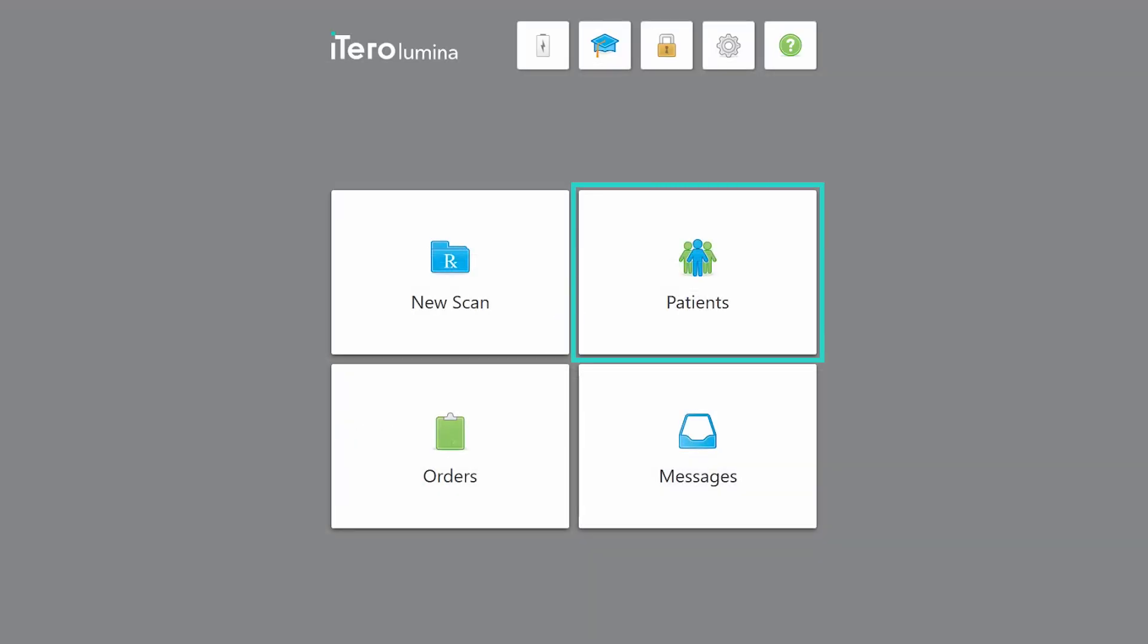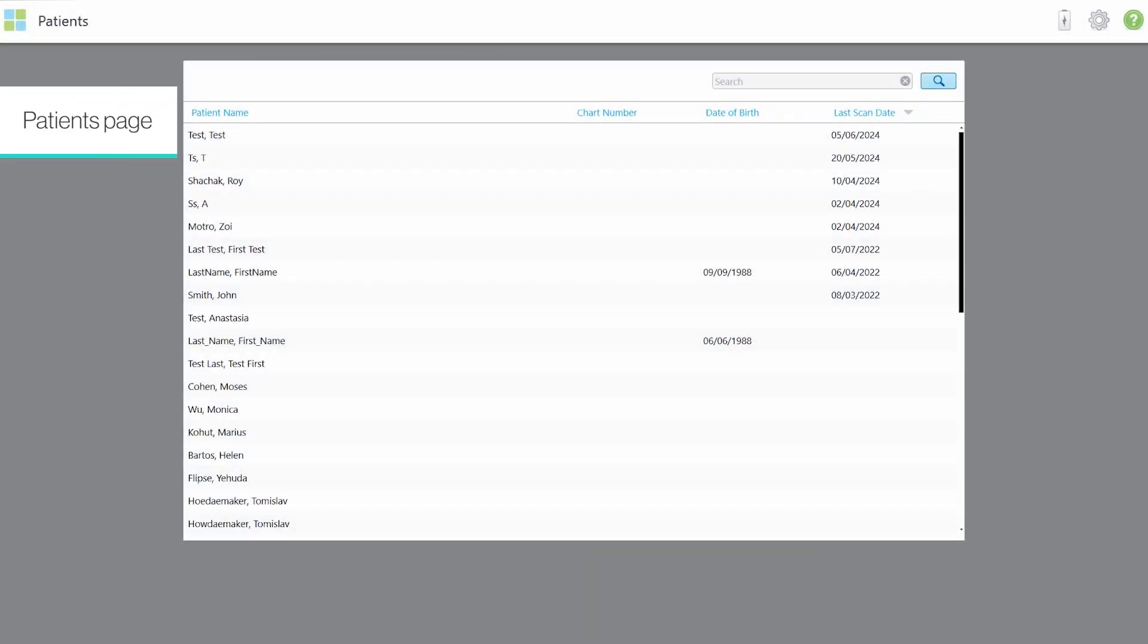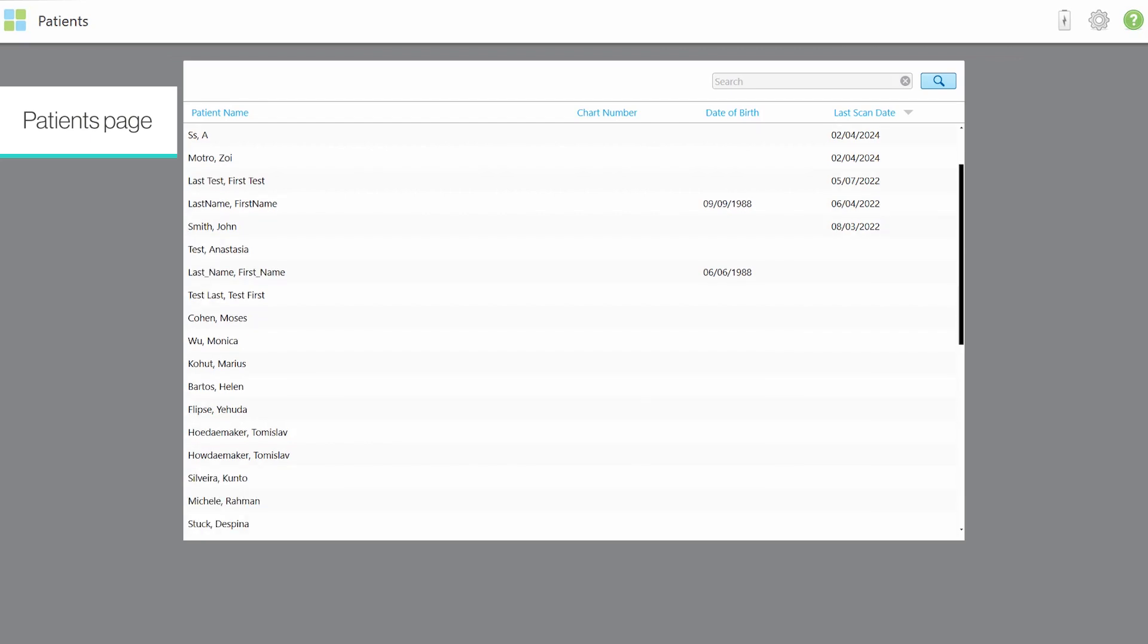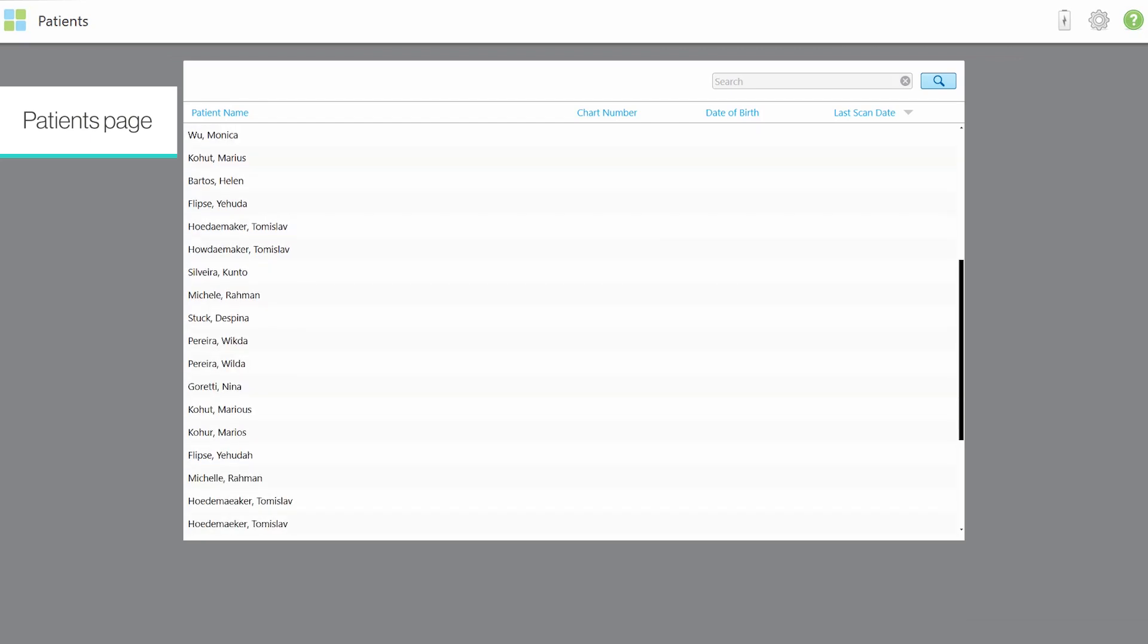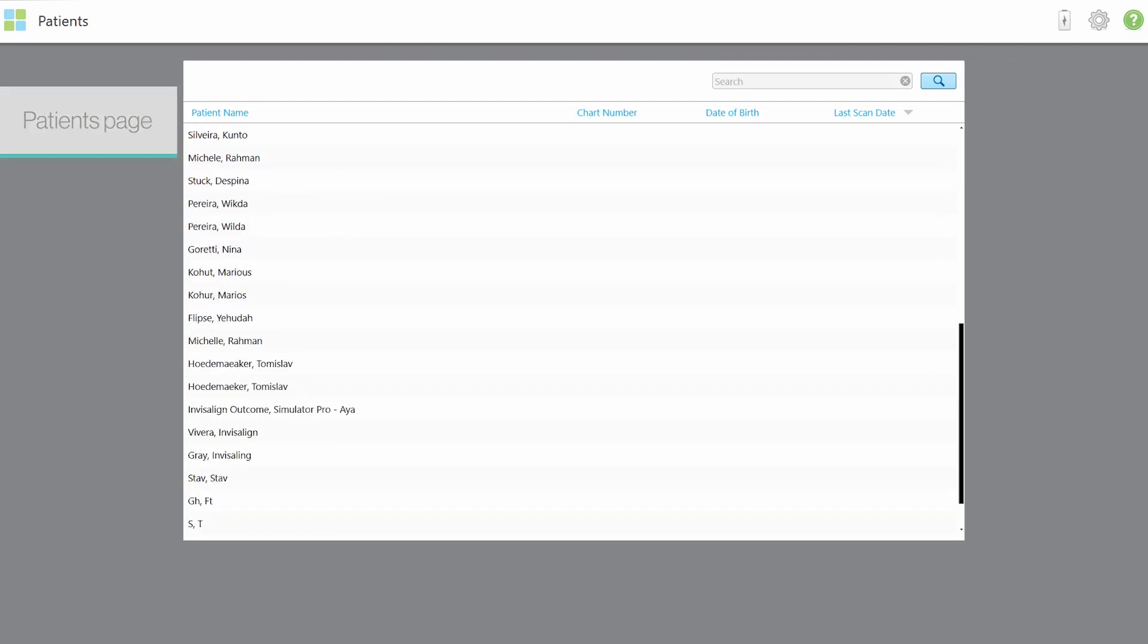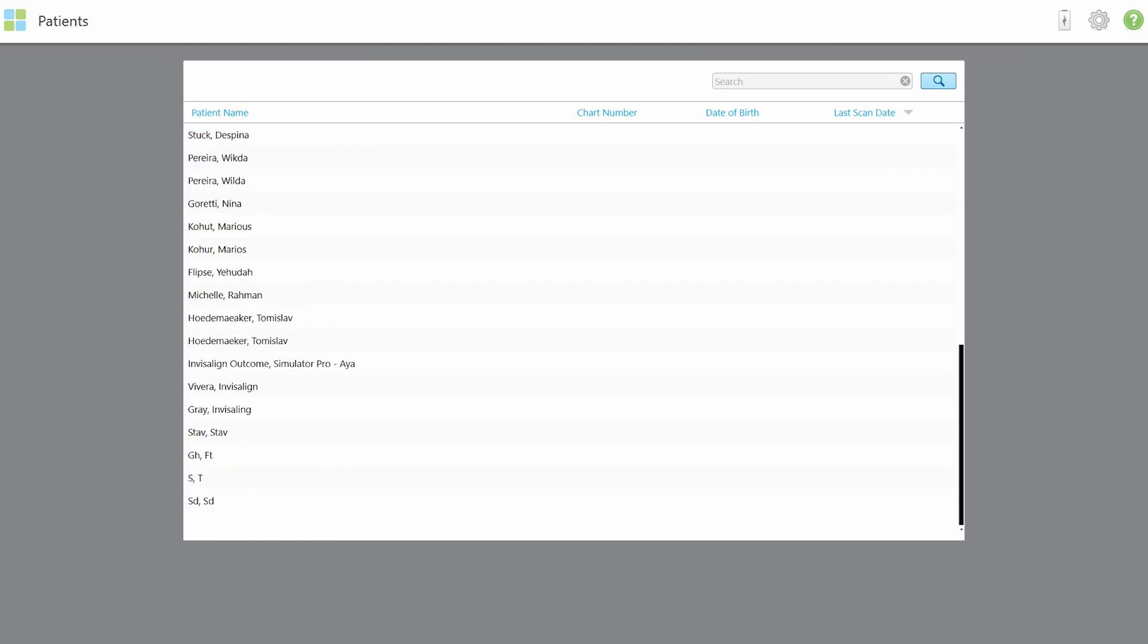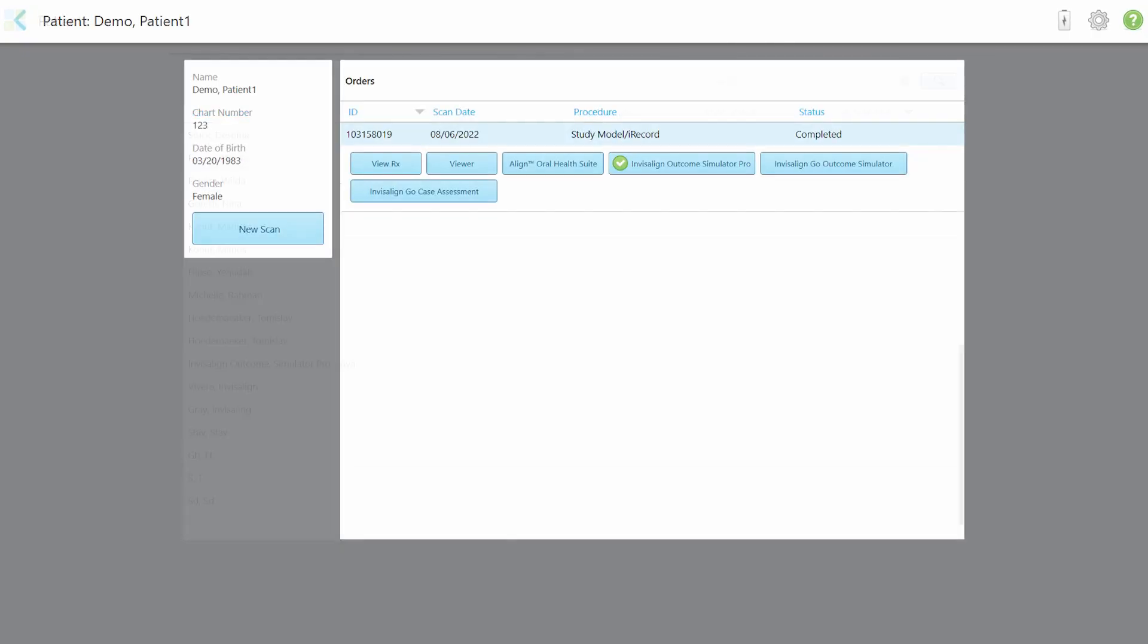Tap the Patients button to display the Patients page. It displays a list of all patients registered in your iTero system. You can search for patients using the search bar on the upper right corner. Selecting a patient enables you to view and compare existing scans for this patient, begin a new scan and more. Tap the arrow to return to the Patients page.